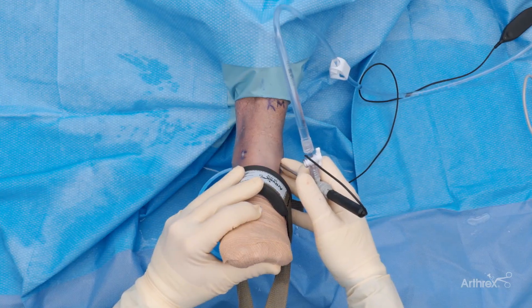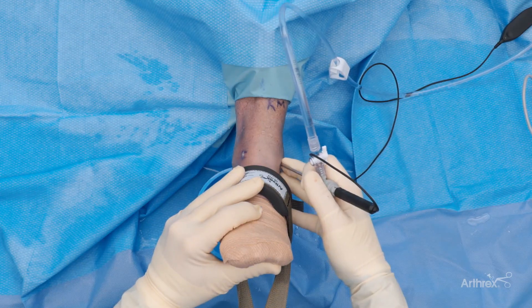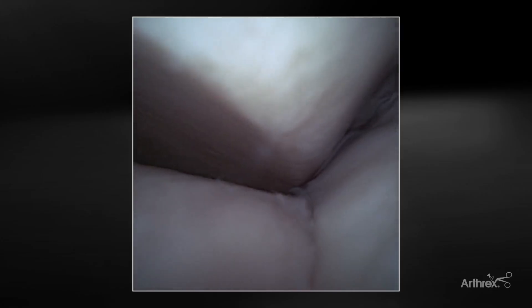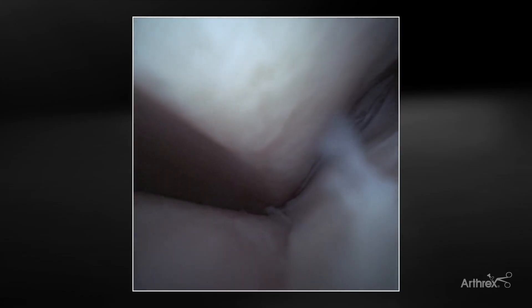Now the next important part is we switch portals and do a direct visualization into the syndesmosis. We can see our talus on the left side of the screen, our tibia on the top, and our fibula. What we want to do is restore and evaluate the Mercedes sign — an anatomic reduction of the syndesmosis — which allows surgeons to evaluate if the syndesmosis is truly reduced. This view must be visualized before and after the reconstruction is done. NanoVision's straightforward viewing allows you to look directly into the syndesmosis without any obstructed viewing.